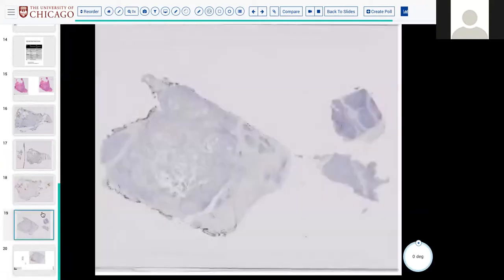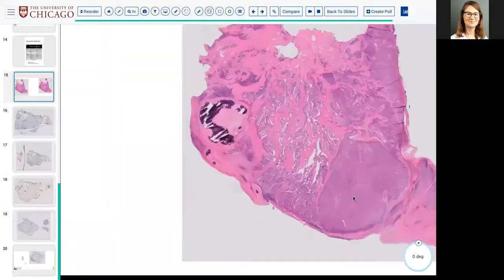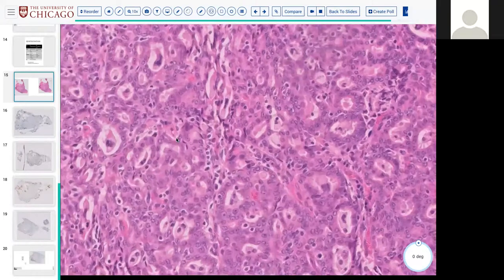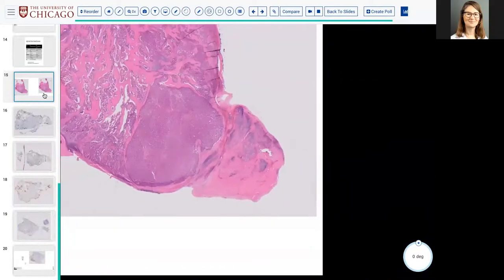Salivary gland, maybe? Okay, so potentially salivary gland. Why do you say that? That's a good thought. Because I'm trying to think about the area, head and neck. So I'm thinking about salivary. Yeah, so, all right, one, yes, you can get metastases to the thyroid.